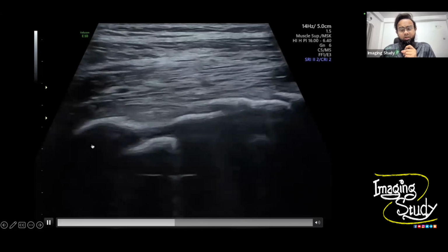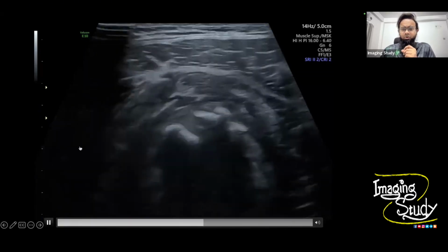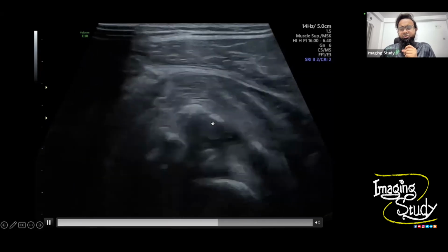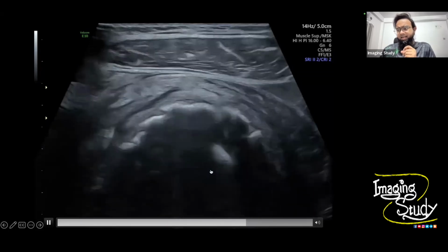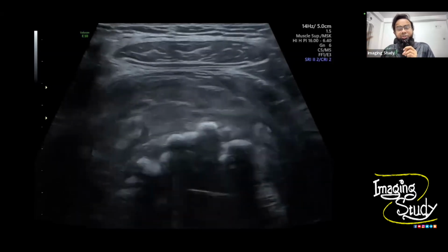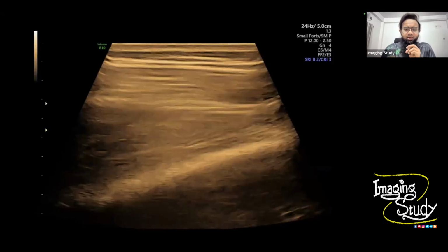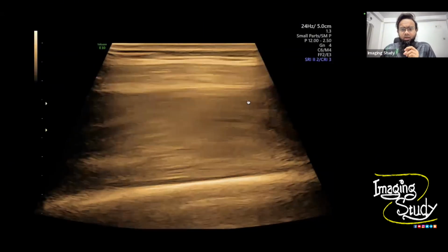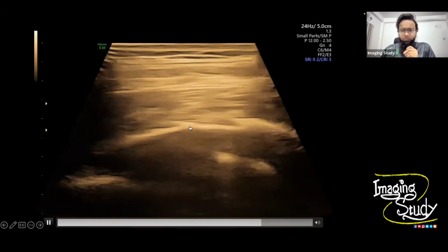That is an intramuscular hematoma. You see, this is very long. So if you put the transducer transversely, now you can see the lesion again. As it's a long lesion, we can easily make a panoramic shot, which will be good, I think. So let's jump into the last video, and now you can see this hematoma here in a different coloring setting.